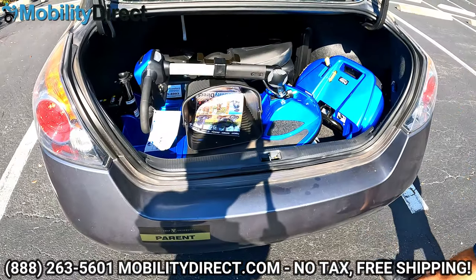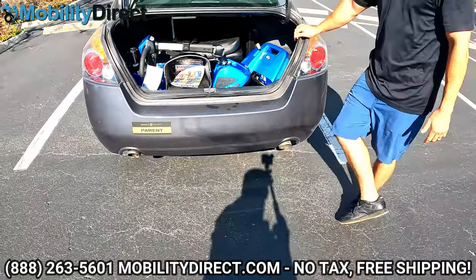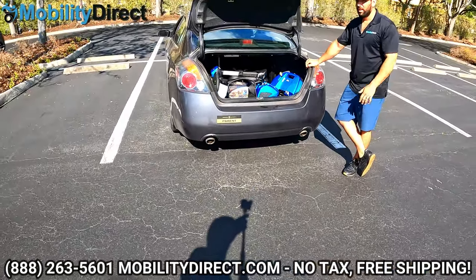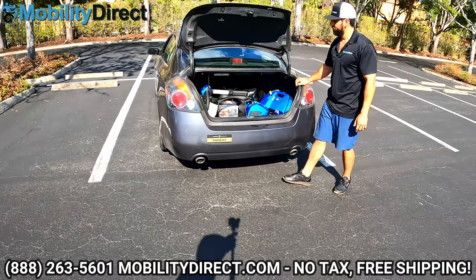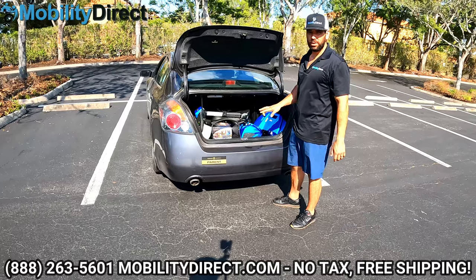As you can see, traveling with this scooter is very possible considering it's a 400-pound weight capacity scooter — that's pretty impressive. If you have a truck or an SUV, no problem; you probably still have room to put things in the back. So let's go ahead and put it all back together.